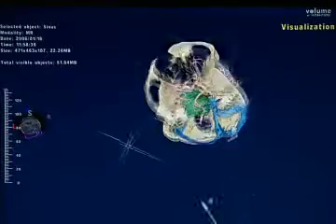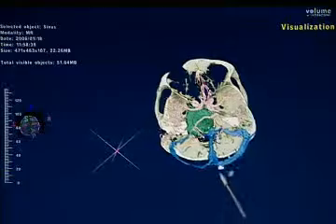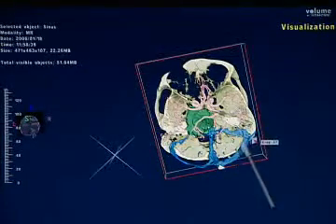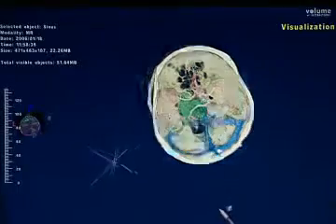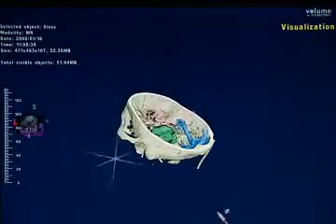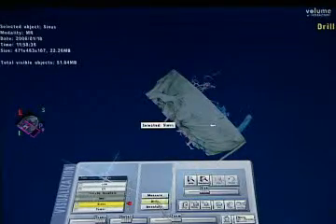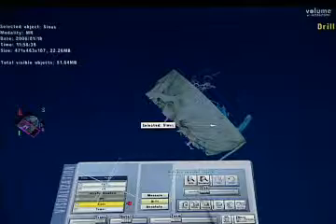Of course, again, you can tell from a two-dimensional image if you're an experienced neurosurgeon, but it may not be readily apparent to a surgical resident who may be seeing it for the first time. And of course, you can put the patient in the desired position. In this situation, we like to operate on them in the park bench position. And so I'll just move on, in the interest of time, to the surgical drilling.